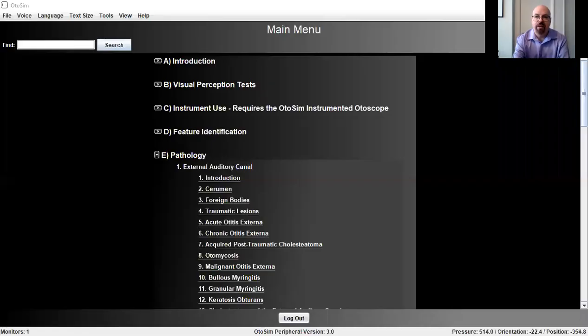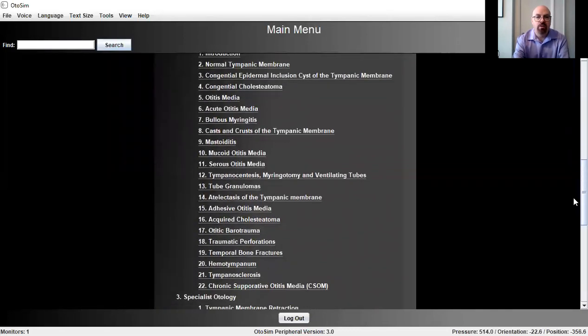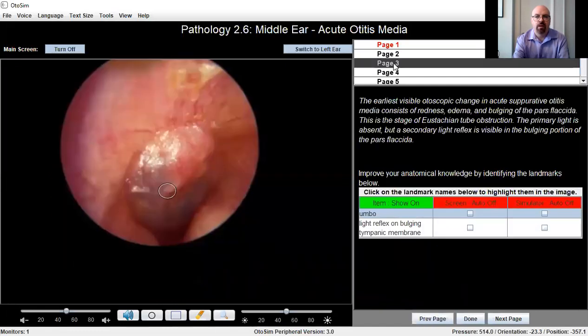So I'm going to go ahead and share the screen here, and we've done so. And here we see the interface. I'm going to go down, just for the sake of making this a short and concise video, go down to acute otitis media. And I'm going to go down to example 3. And here I want to show you the menu on the bottom. You've got several important icons to use for a video presentation. You've got the circle, so I go ahead and press that.